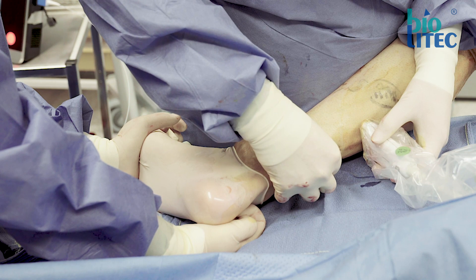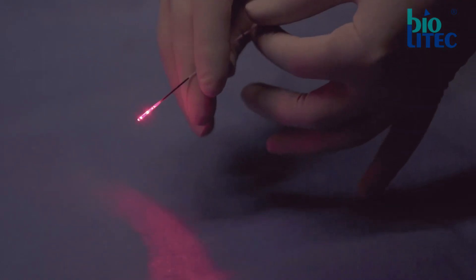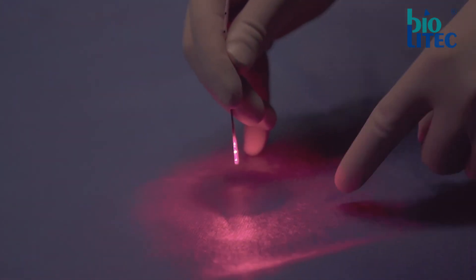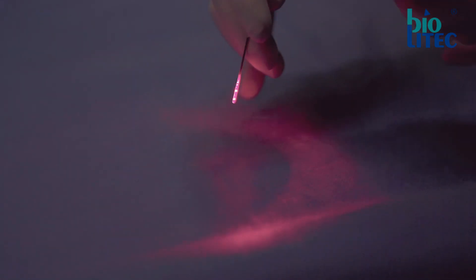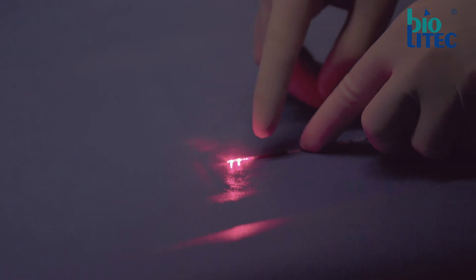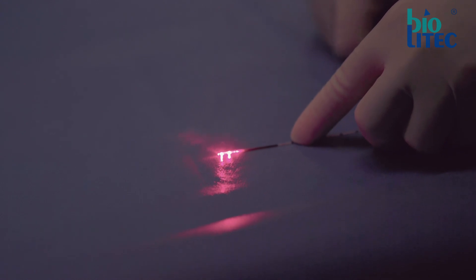Puncture of a smaller vein can be performed perfectly in supine position. As mentioned before, we use a slim double ring radial fiber. Because of the design, the power density of the laser light is low, avoiding carbonization of the catheter tip and a cascade of problems: lack of energy transmission, extreme focal temperature rising, vein carbonization and perforation, and fiber tip destruction.